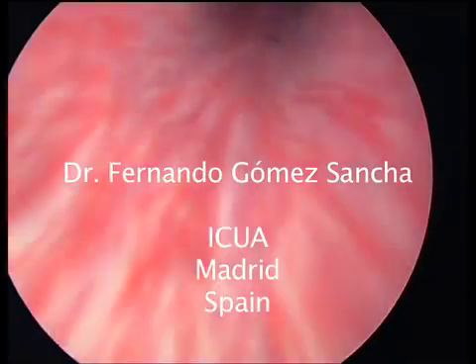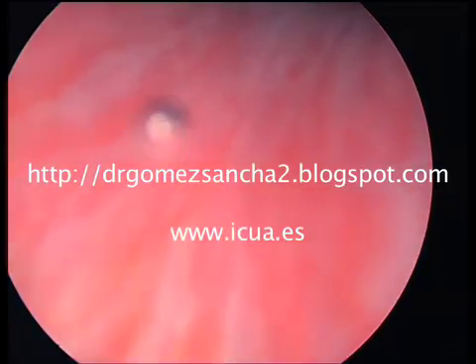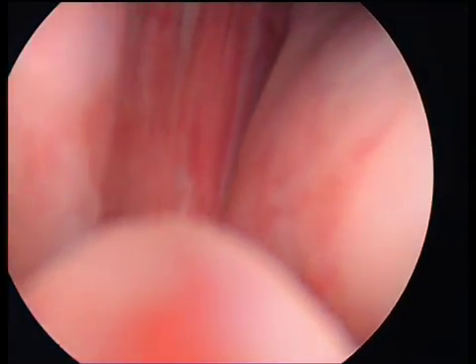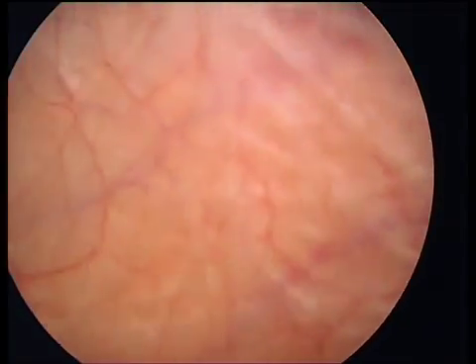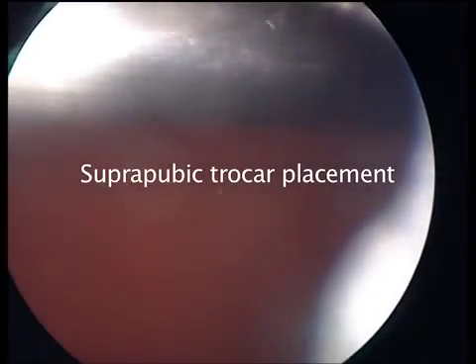This is Fernando Gomez-Sancha and this is a video of a GreenLight HPS laser prostatectomy on a patient with a 130 gram prostate. These prostates are very big and irrigation is very important, so I usually place a suprapubic trocar for these difficult cases.